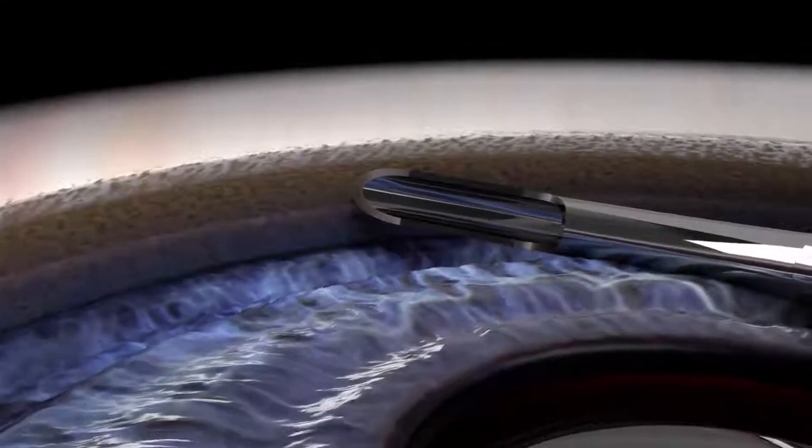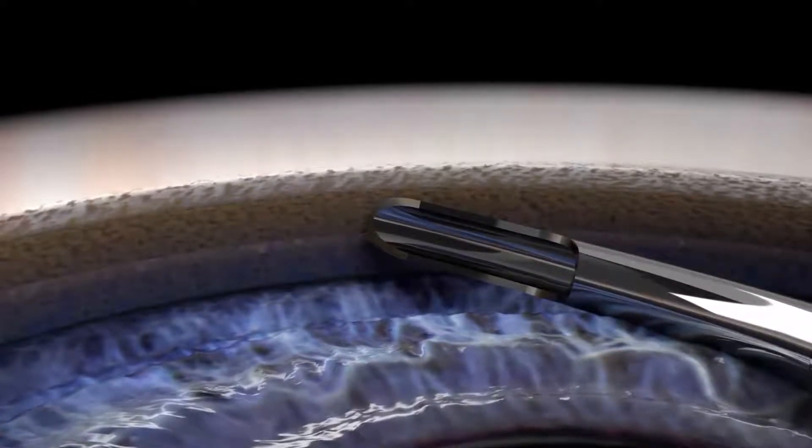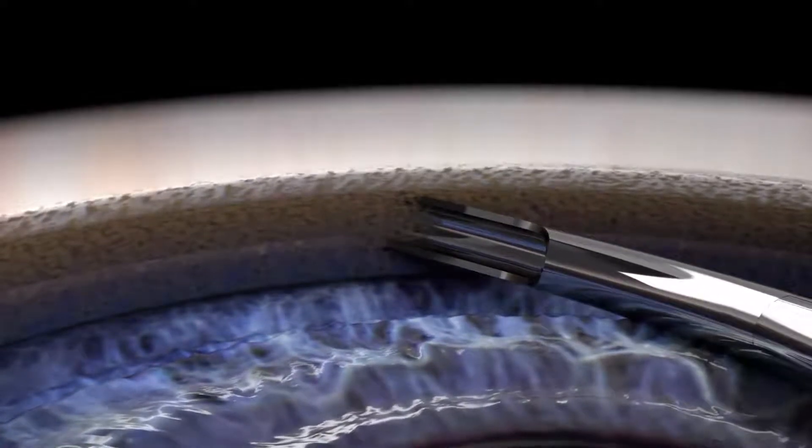Once through the trabecular meshwork, hold the cannula steady with light contact against the back wall of Schlem's canal.